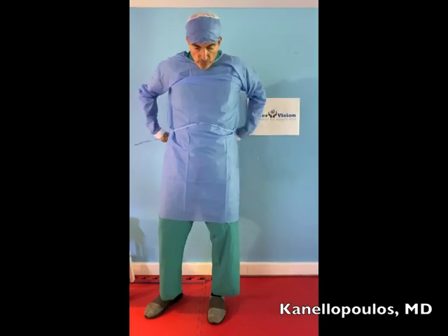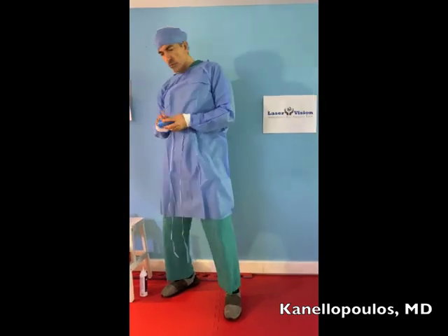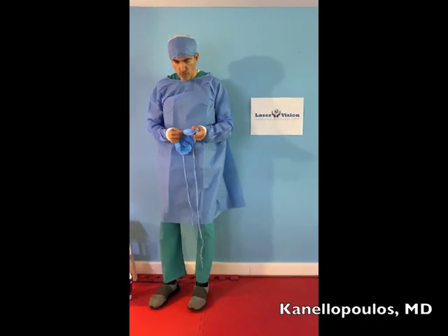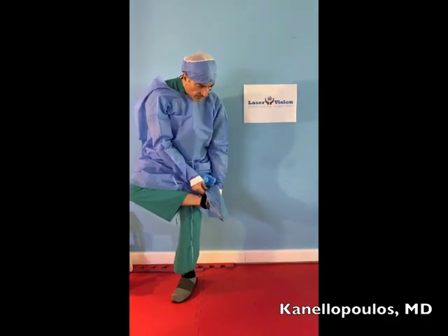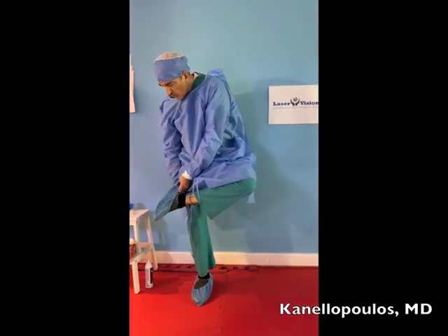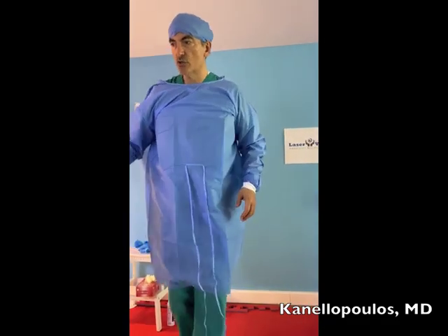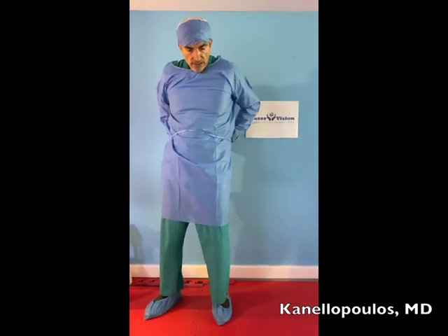We're going to tie this theoretically behind our back, and then we're going to wear booties. This is important as well — make sure that they don't tear and we get fluid from the floor onto our shoes. I invariably spray the bottom of my shoes with antiseptic whenever I change room or floor, to make sure I'm not transferring droplets that may land on the floor from one room to another.